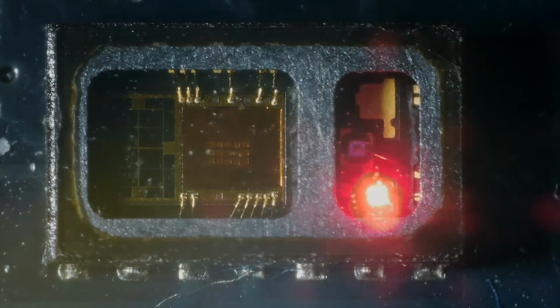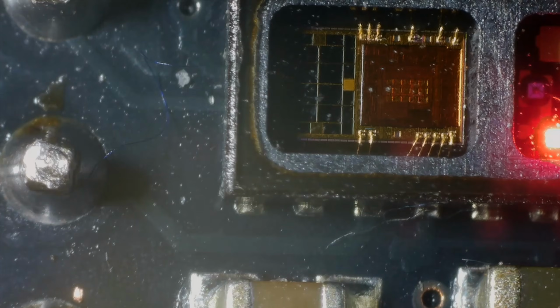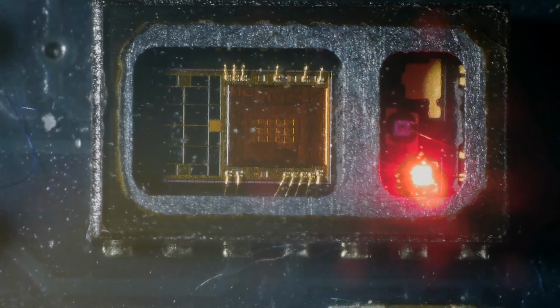But yeah, that's pretty fascinating to see. So we have the red LED and we have this nice infrared LED lighting up. And then you basically stick your finger on top and it detects the pulse rate using the red LED and it detects the oxygen levels using the infrared LED. Yeah, pretty interesting. But let's try it out, see if it actually works.